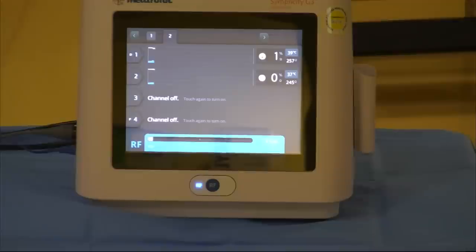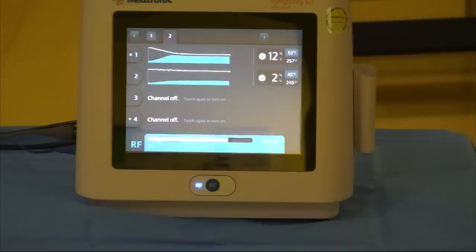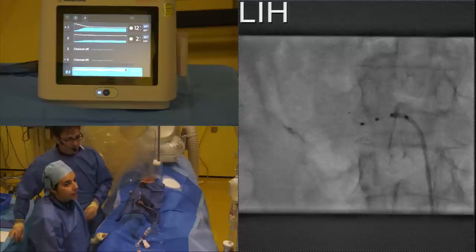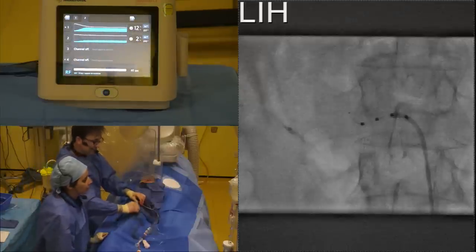Colin, I know that you've done a lot of denervations at your center. One of the things which we wish for is a little bit less patient discomfort. I think this is a considerable improvement. Certainly I think from the perspective of patient discomfort is very important. It might make your social entertainment in the catheter lab a little bit less, but you don't have these 15 minutes to speak. What's happening with two? It's really a very low temperature rise. And it may be there is a little bit of atheroma as it comes proximally. I may be just in that or it may be the contact's not quite as good. The starting impedance was very good, though.